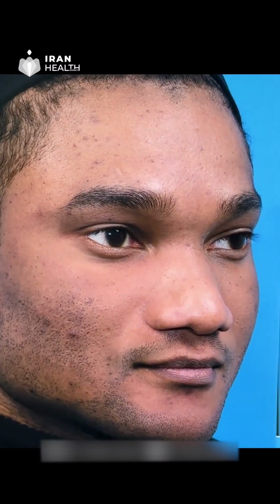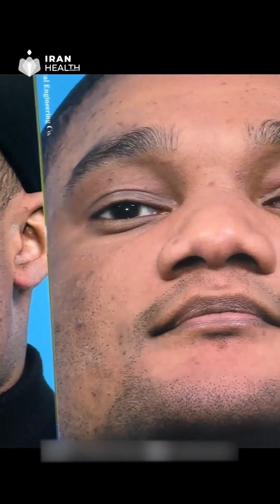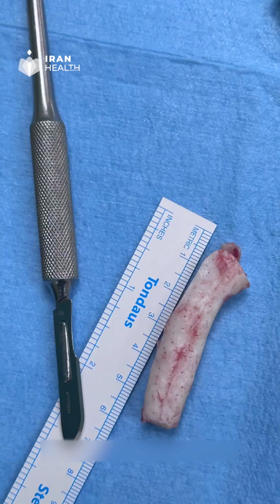When exposing this typical African nose, the deformities of the nasal tip and also the nasal dorsum need to be addressed with routine procedures of augmentation of the dorsum and touching the nasal tip, but there are 2 or 3 points that must be mentioned in this case.